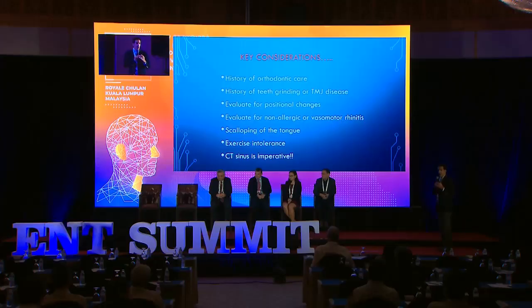Positional change we talked about, patient being up versus lying down. We lay them down in our clinic. We actually ask them to lie down 15, 20 minutes, take a look in the nose afterwards, see what changes. I noticed that, Michelle, you decongested the patient, then you looked in the nose with the endoscope. Yeah. So I always yell at our fellows, never decongest the nose until we examine the nose, because you can see a lot of issues.